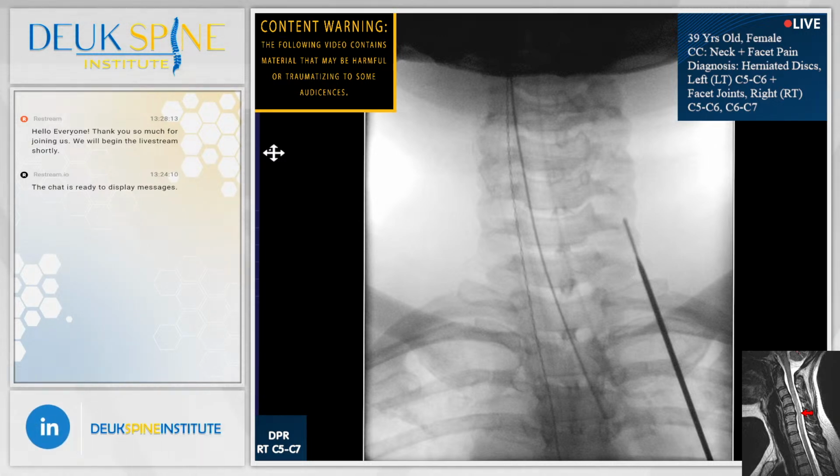We start the surgery with a 4 millimeter incision. 4 millimeters is tiny in the back of the neck. That's what I just made, is that incision. And blood pressure is good. Yep, 92/60. All right.